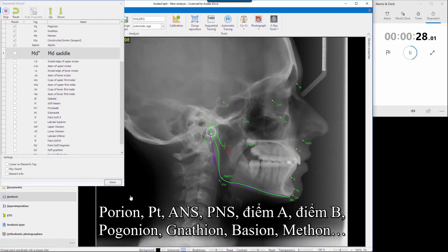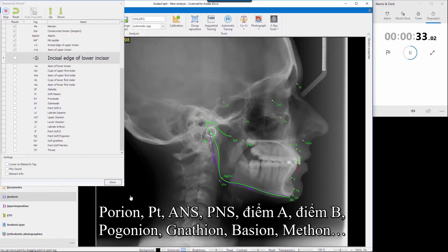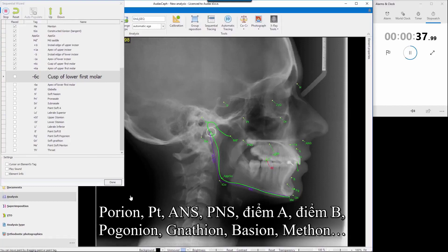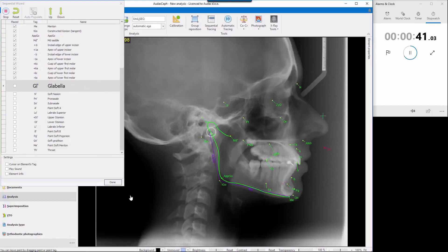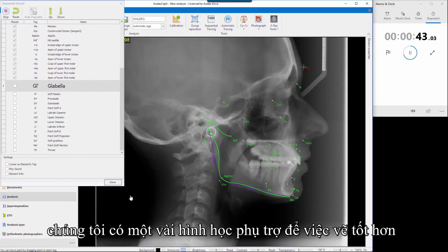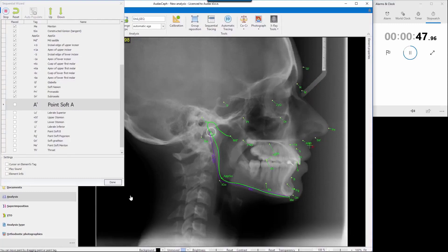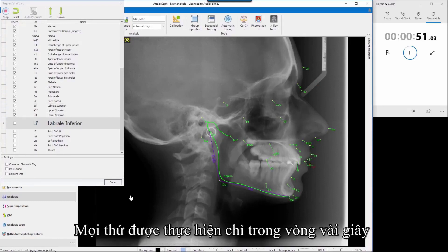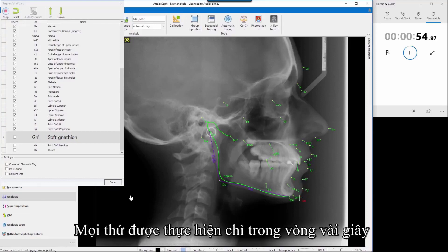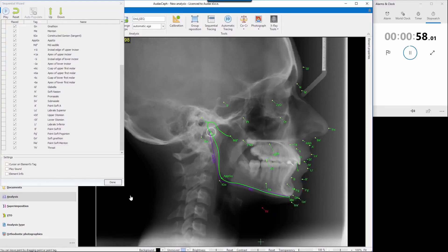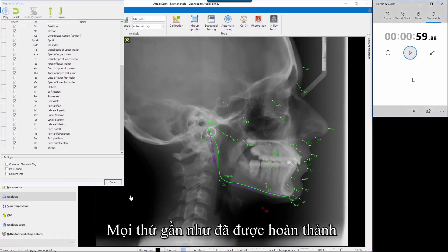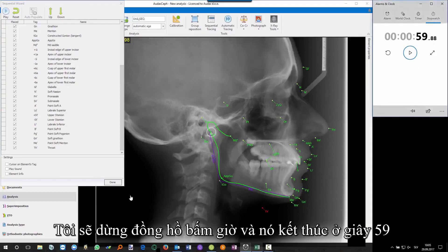We have some auxiliary geometry for better tracing. Now incisors, molars, and at the end we'll also trace soft tissue. We'll be done in a few seconds — both stomions here. I'm almost done. I'll switch off the stopwatch and it's 59 seconds.